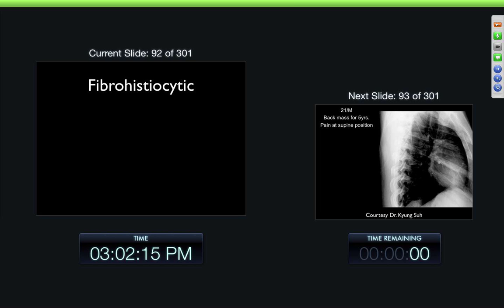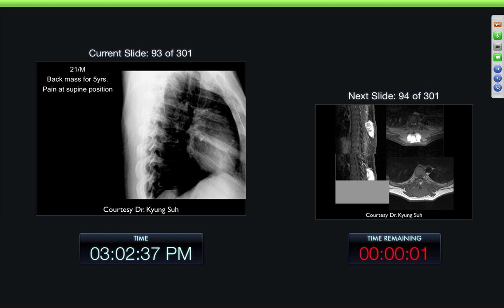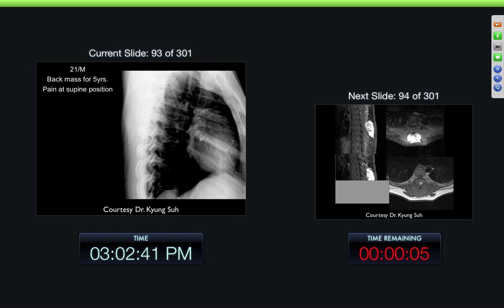We went through some other lesions, including lipid-type soft tissue masses and fibrous soft tissue masses. So now we'll go on to the fibrohistiocytic. This differentiation is really based upon histology findings at the time more than anything else, and we're not going to go through the histology here. We're really talking more in terms of the MR.